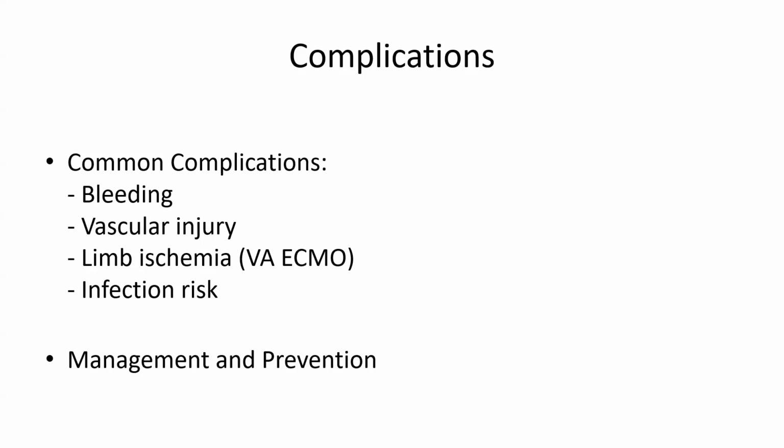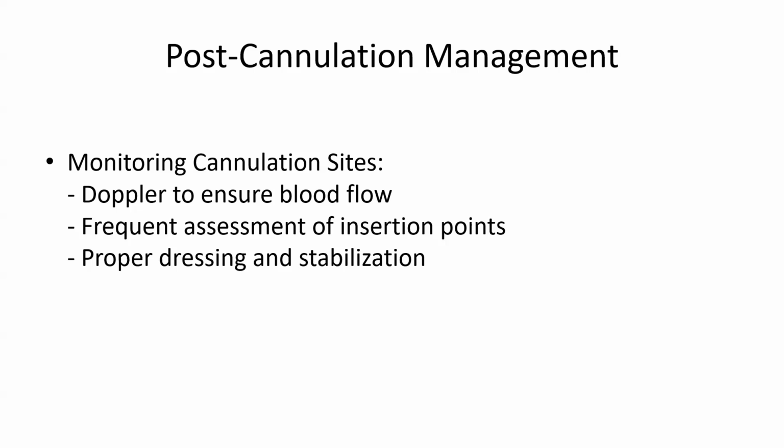After the cannulation, we have to check whether the sites are clean. They are covered with sterile dressing, which is transparent. There is no bleeding or hematoma around the cannulation site. All these things have to be checked. And also the cannula position, how much cannula is in, how much is out, that has to be checked.